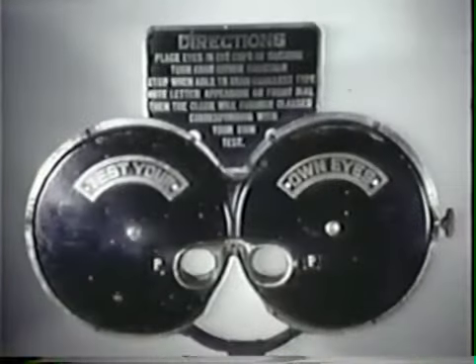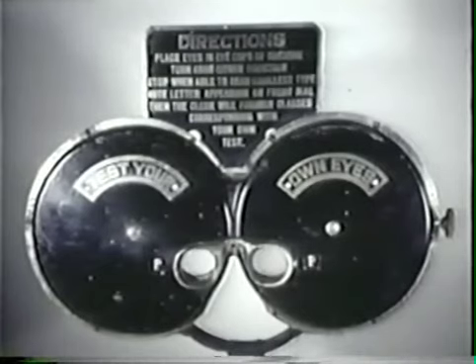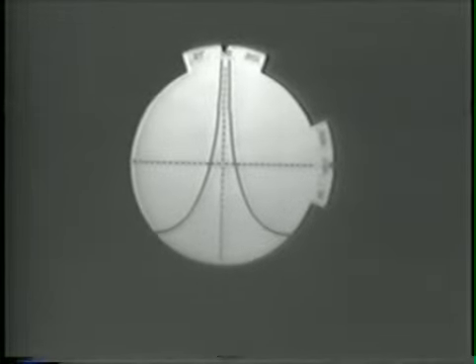In the 19th century, subjective refraction was often performed with rotating discs of spherical lenses for the correction of myopia, hyperopia, or presbyopia. Astigmatism was more complicated to correct, however, and astigmatic dial targets were devised, first to locate the axis of astigmatism and then to balance the refractive correction in the two principal meridians. The astigmatic dials are still used by some refractionists, but they can be difficult for patients to understand.